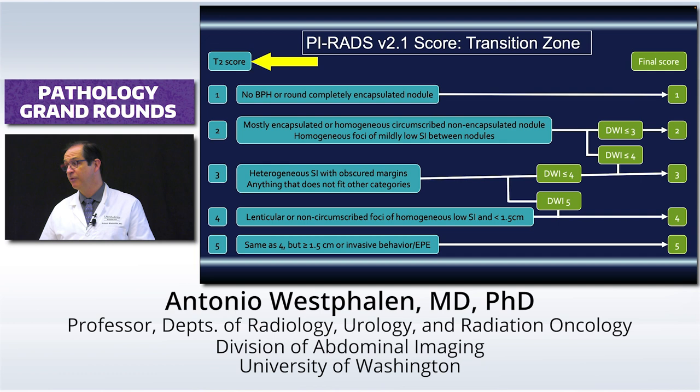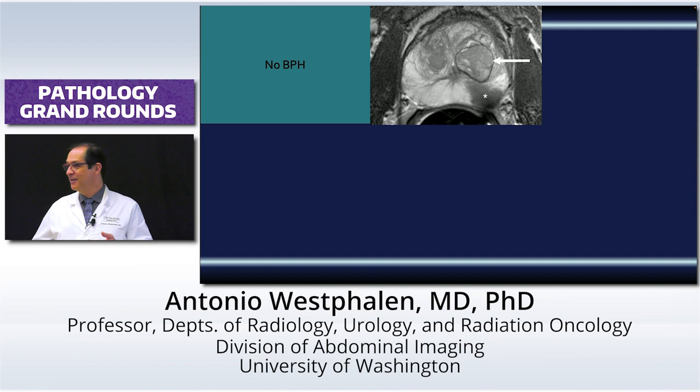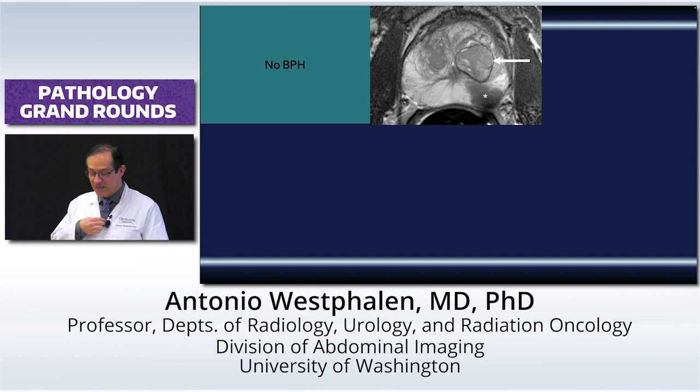Now, what does a BPH nodule look like? First, they have a category that talks about no BPH. I have no clue what planet they come from, but no BPH doesn't really exist, right? Unless you've got a kid. But they don't happen to really have prostate MRs done, so it doesn't really exist. We never see that.